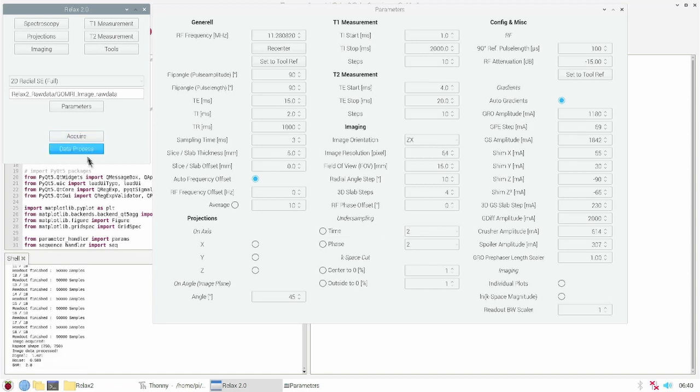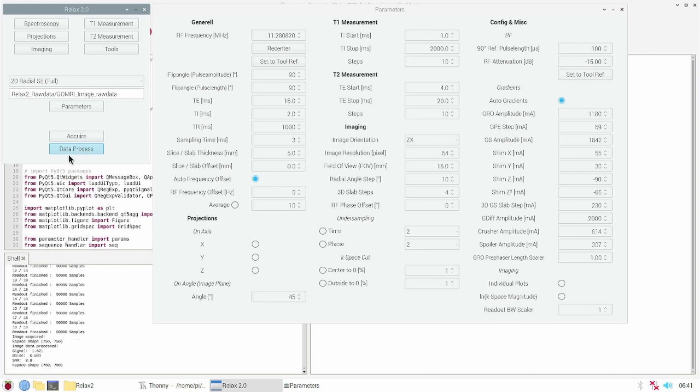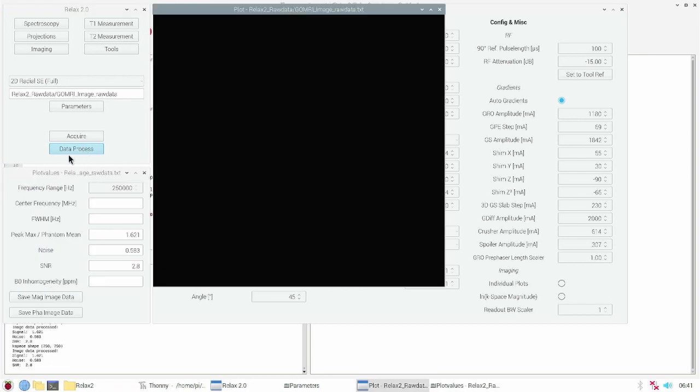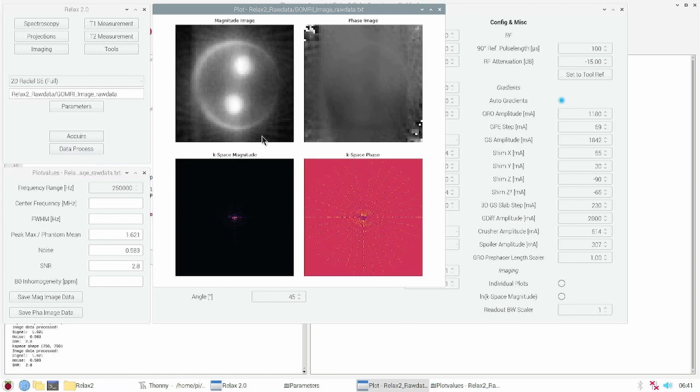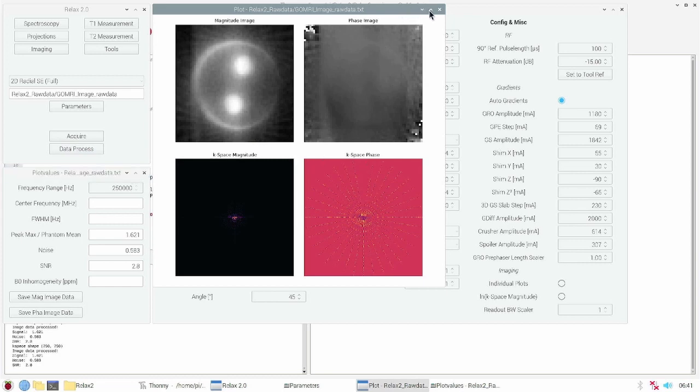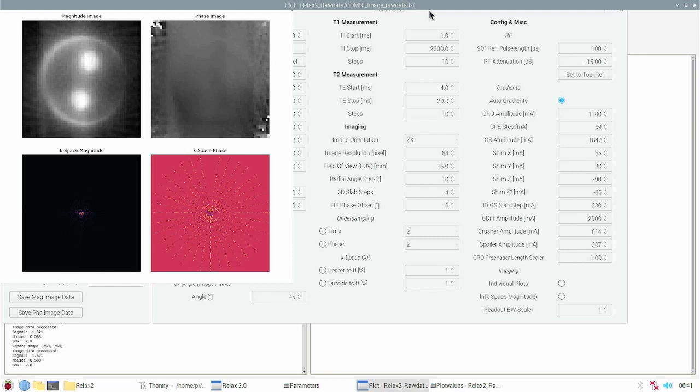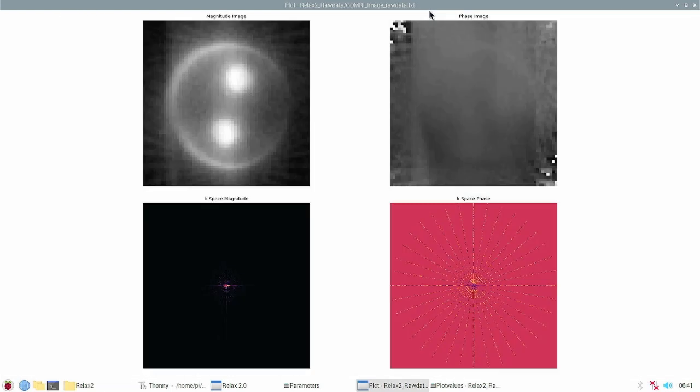After the measurement we can reconstruct the image by pressing data process. This will reconstruct the image from the radial data which is sorted in the k-space. With more angles you get more detail in the images, and now you surely can see the two hole probe.